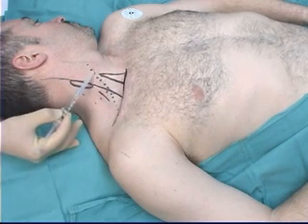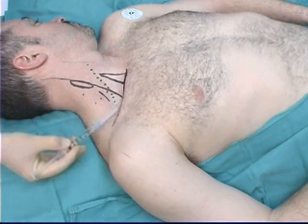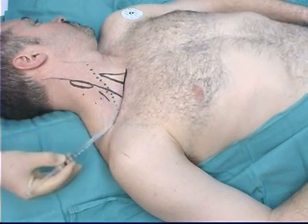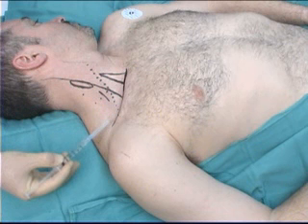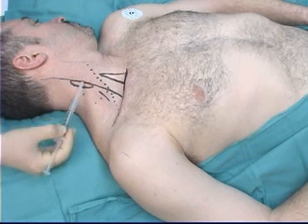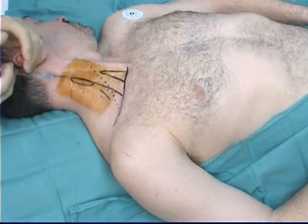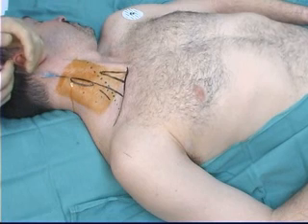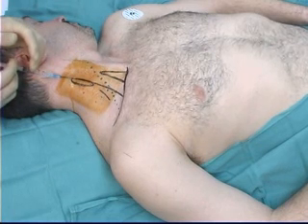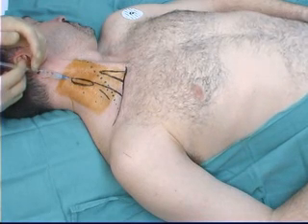This line marks the posterior border of the sternocleidomastoid muscle. The broken line indicates the external jugular vein, and the clavicle forms the caudal border or base of the posterior triangle of the neck. The circled area indicates the position of the superficial cervical plexus. After disinfecting the skin, the superficial cervical plexus is blocked just behind the midpoint of the sternocleidomastoid muscle.